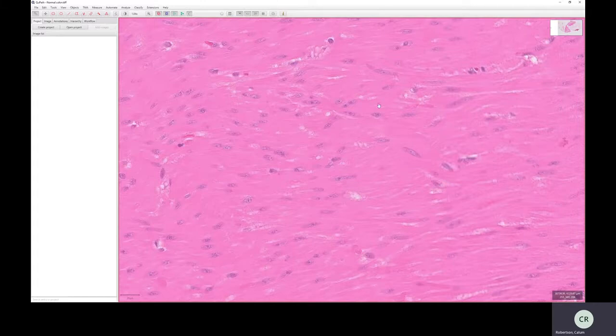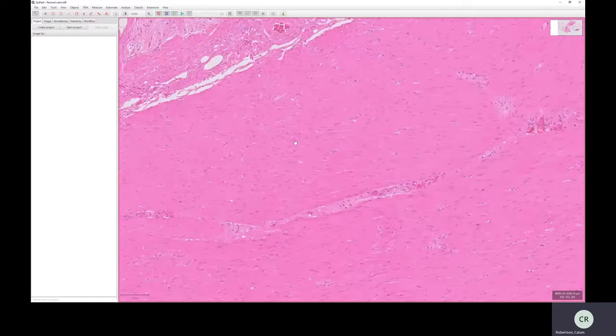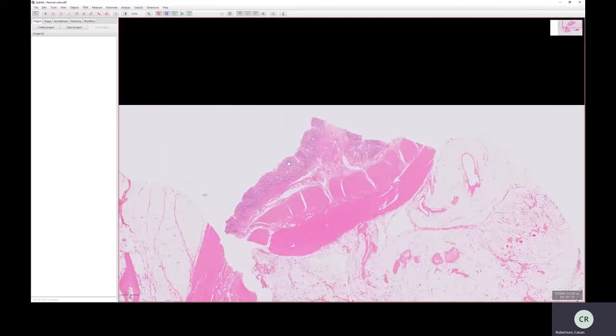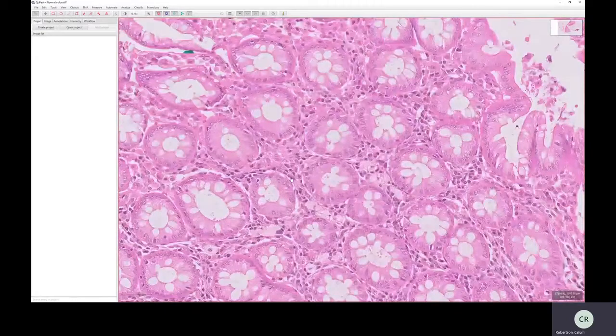Nothing really looks like that. Fibroblasts can look a bit similar, but they don't tend to have the blunt-ended nuclei. So that's smooth muscle cells. The second thing I wanted to show you was a cell that we couldn't see in the skin.